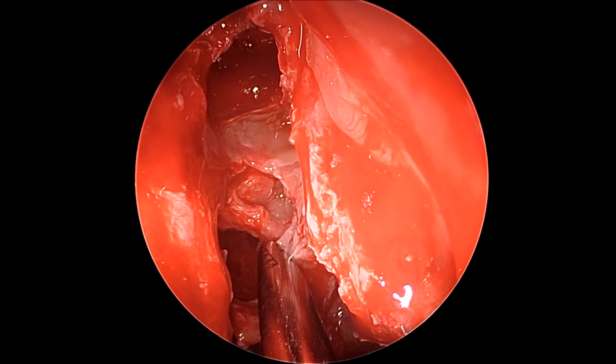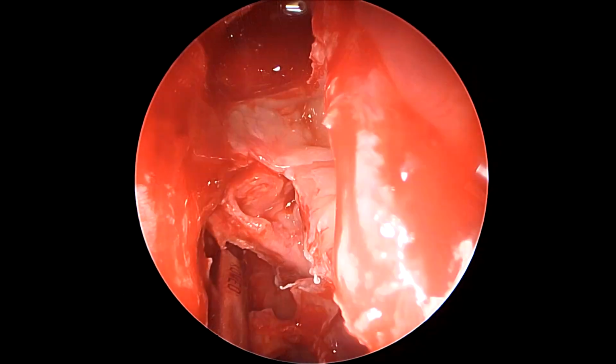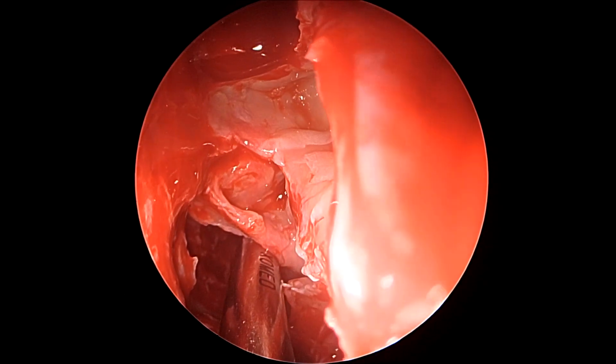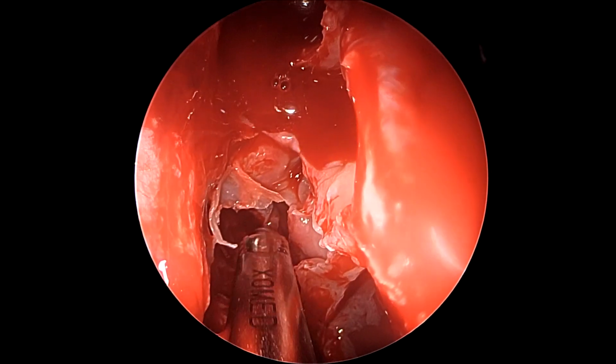Here we are using the debrider blade inside the posterior ethmoidal cavity. It does appear that there are a few cells still left to be dissected inside the posterior ethmoidal cavity, and we shall shortly dissect them as well.